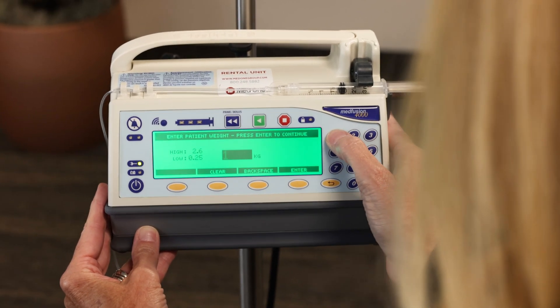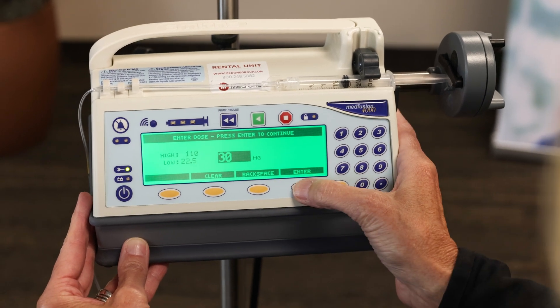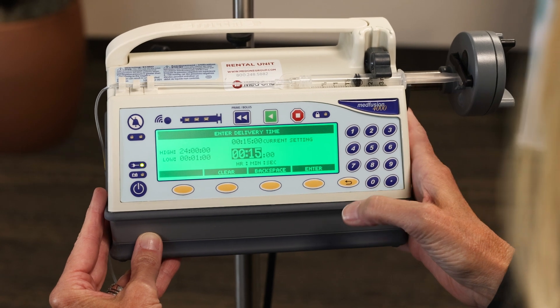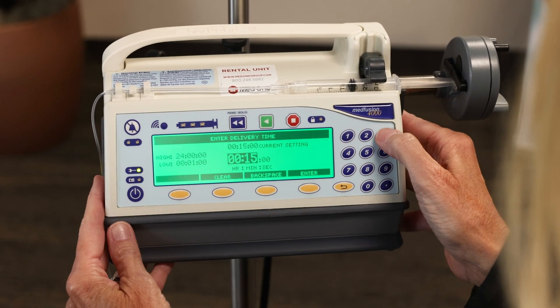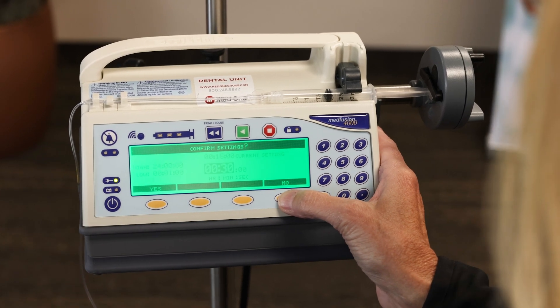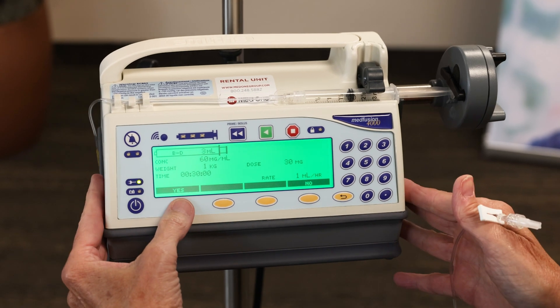My patient weighs one kilo. We're going to do 30 milligrams, and I'm going to press enter. I'm going to give this over 30 minutes instead of 15 minutes, then press enter. And I'm confirming that these are my settings by pressing yes.